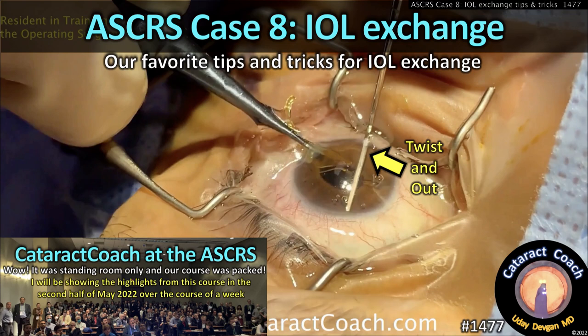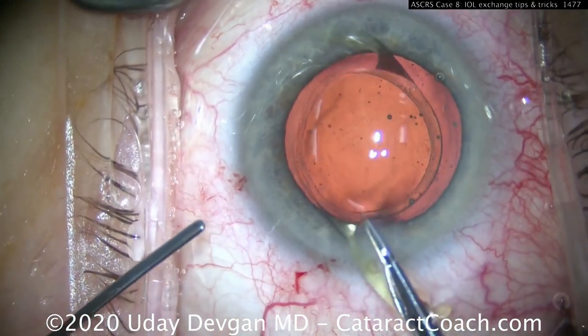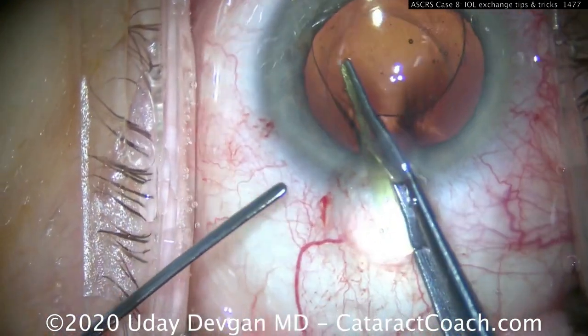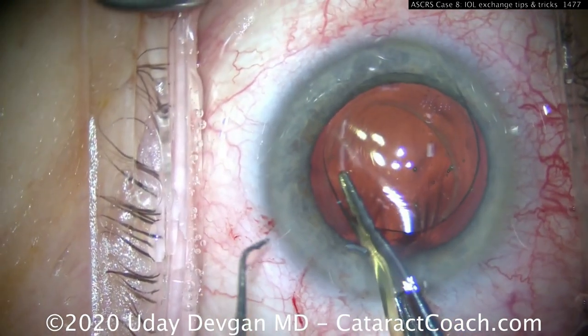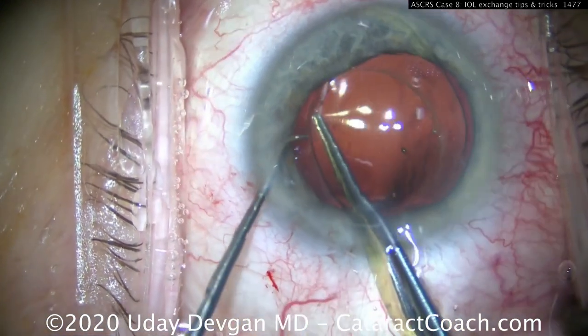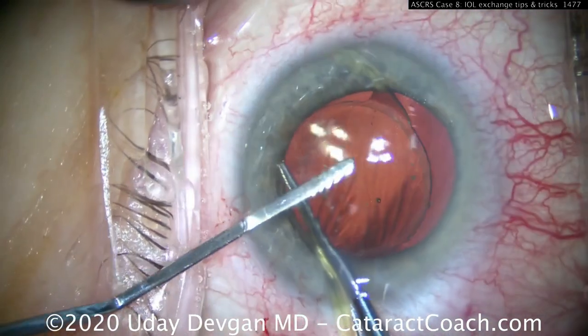Welcome to cataractcoach.com ASCRS case number eight: IOL exchange. Here are our favorite tips and tricks. This is the twist-and-out technique — the IOL is free from the capsular bag, being held with nothing more than straight tying forceps in the right hand. The left hand has a chopper initially just to help get a good grasp of the IOL, which is held at the optic edge with one haptic outside the eye.